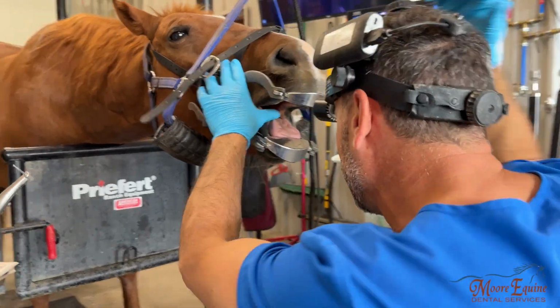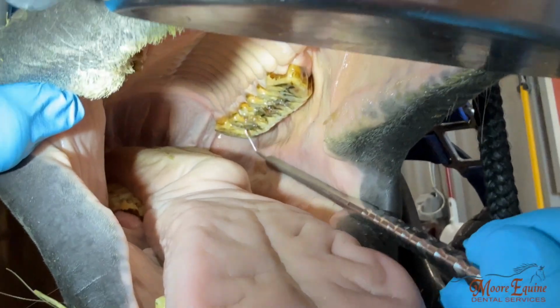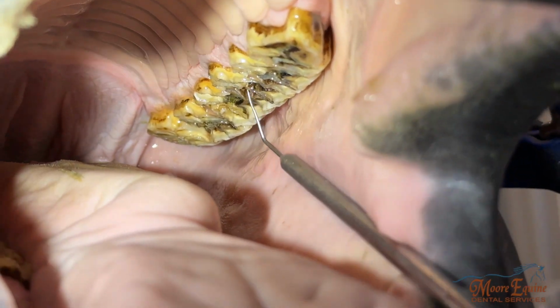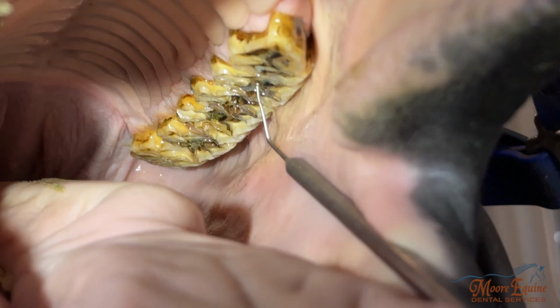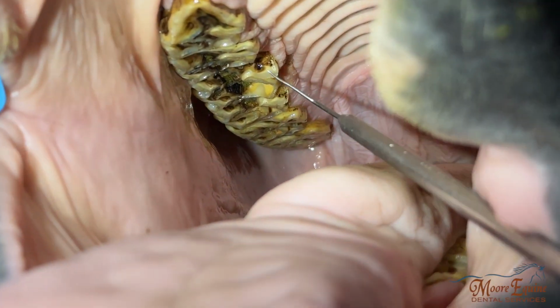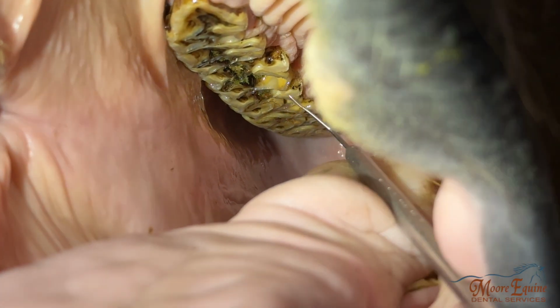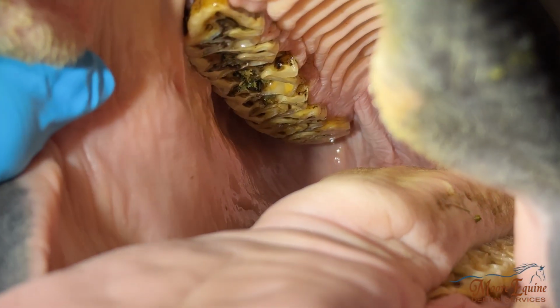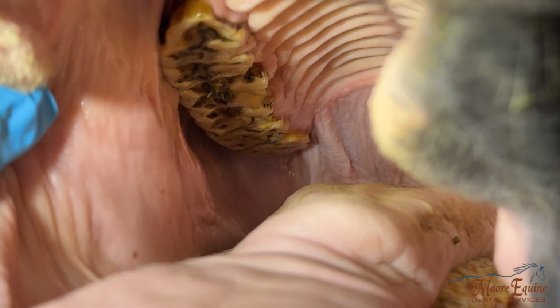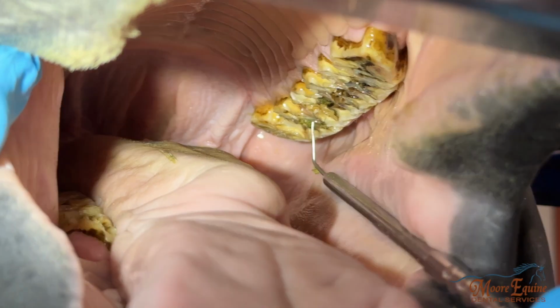Let's take a look in the mouth. So if we take a look in the mouth and we look over at this side, we can see how there's a lot of dark spots in between these teeth here in the center. And then if we go to the other side, we can see where some of these teeth are starting to break. So these are infundibular caries, and they can lead to a structural weakness of the tooth. So we'll show you guys with the endoscope now how some of these are starting to break up and what we can do to fill them. It's a very, very good procedure.